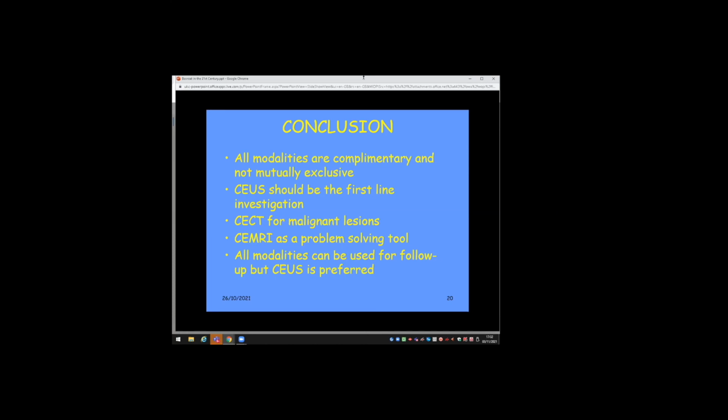Absolutely, Roger. And the last case, CT showed a hyperdense cyst. A repeat CT was asked to look again at the hyperdense cyst. And the person reporting the repeat CT said in the report, why am I doing this? You should have sent it for ultrasound. So even the radiologist looking at it on the second CT questioned why the first CT requested the second CT. Anyway, we did an ultrasound and it was a simple cyst.